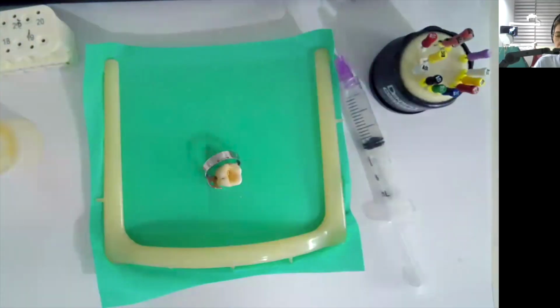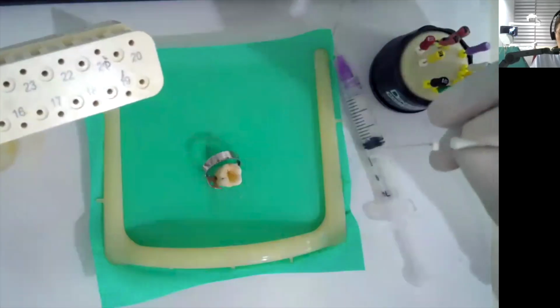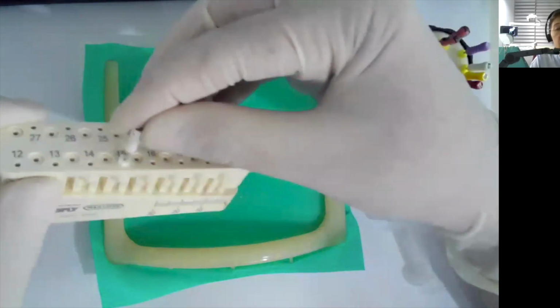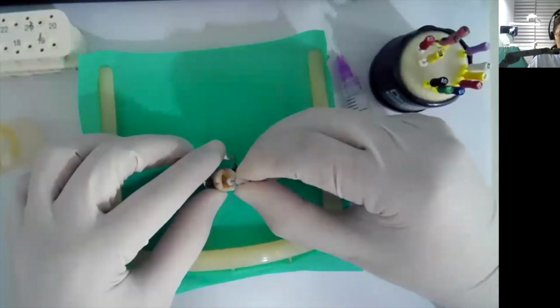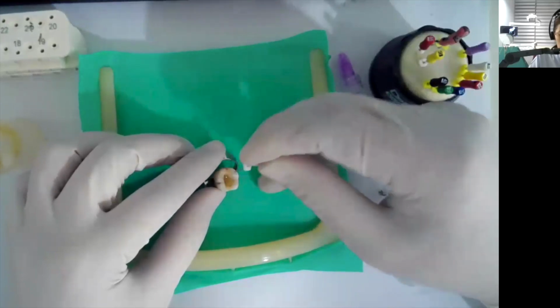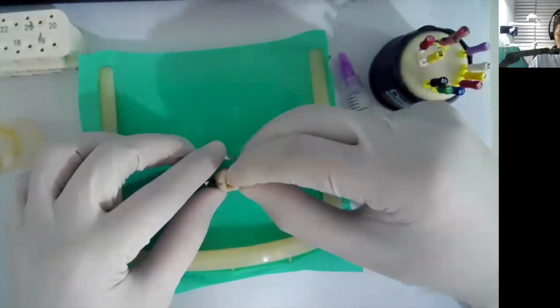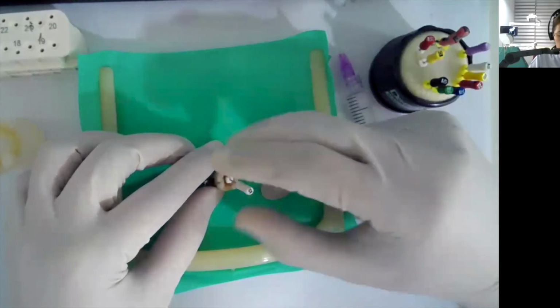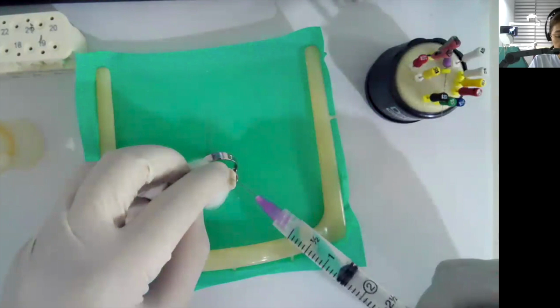I'm going to try to reach the middle third now. Where should you really stop? You stop at the curvature. I'm now going to use the size 45. So I'll just insert this size 45, maybe 15. Okay. I'll do clockwise rotation, reaming, and then counterclockwise. And then I'll go to the mesiolingual, and then distal. So irrigate again.